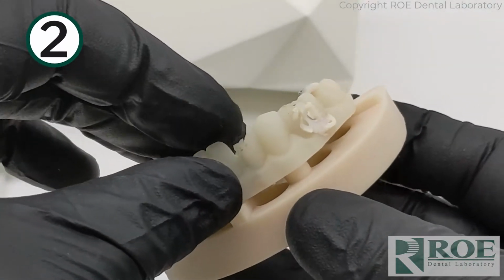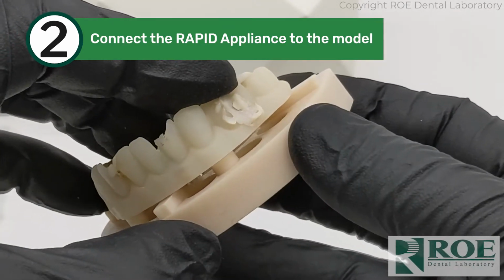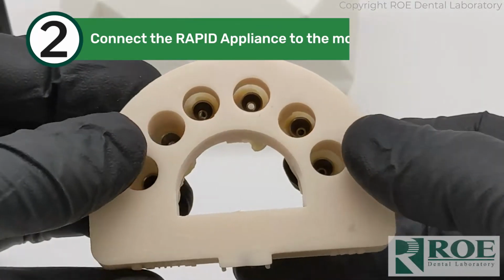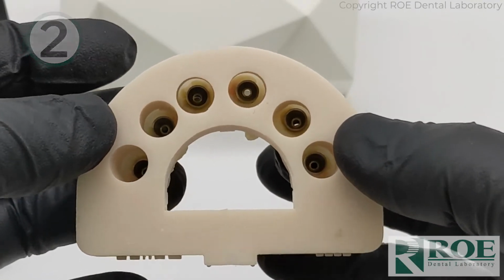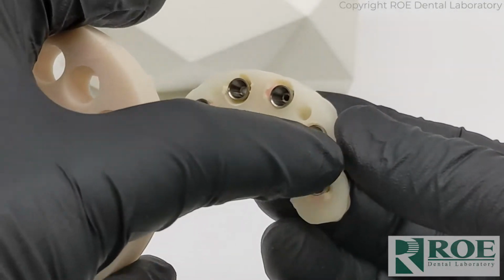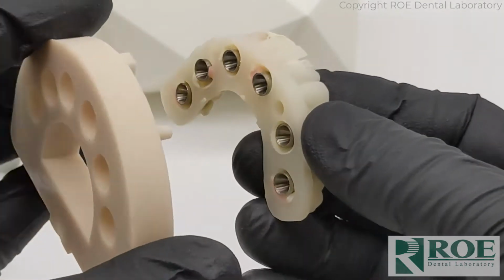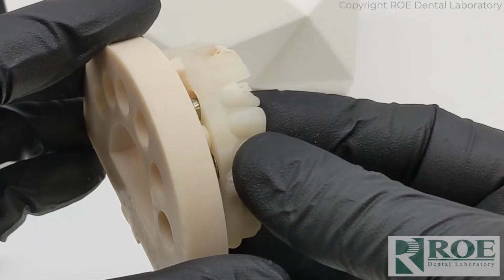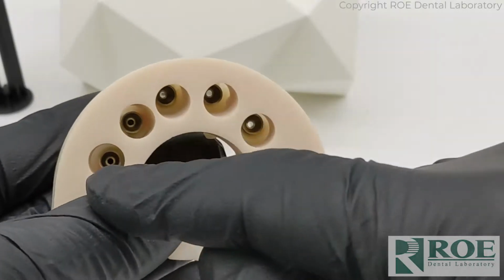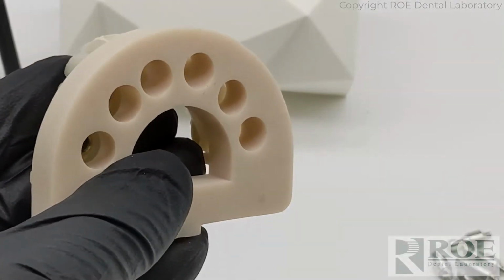Step 2 is going to be connecting the RAPID appliance to the model. And we have a lot of videos on this with the C2F technology that shows the process. Essentially, you're going to add multi-unit abutment analogs to this prosthetic. You're going to plug the 2 together, and then you're simply going to backfill to connect the analog to the model. And we'll do that demonstration now.